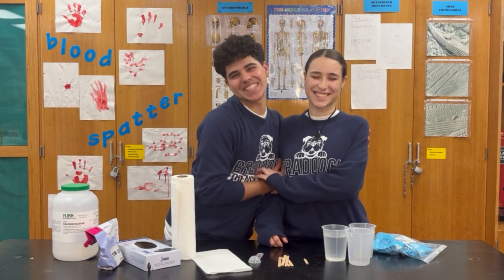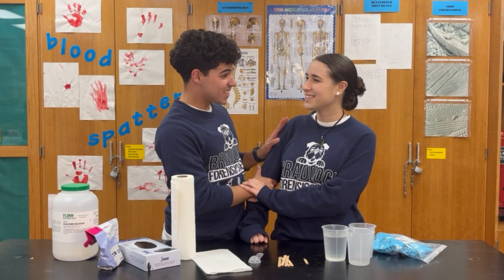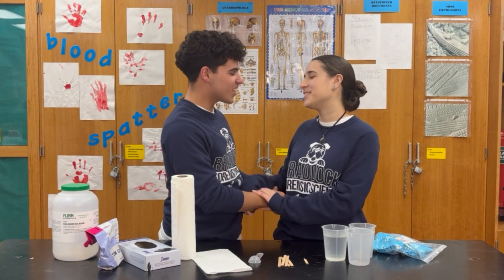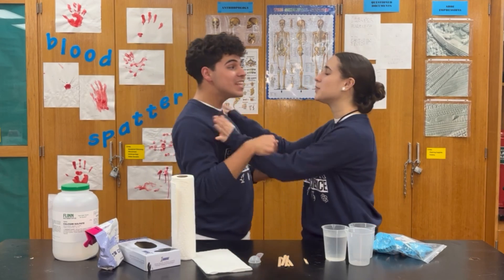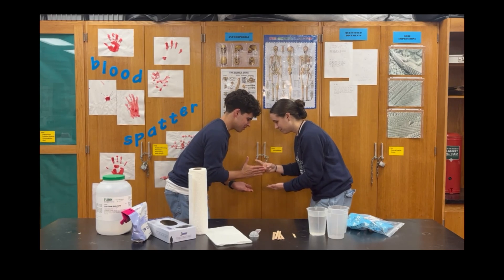And the last thing you need is a patient. We didn't specify which dental impression we're doing — it's yours. After some protest, Maryam will be taking my dental impressions.